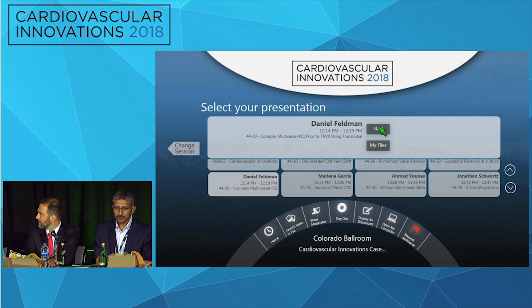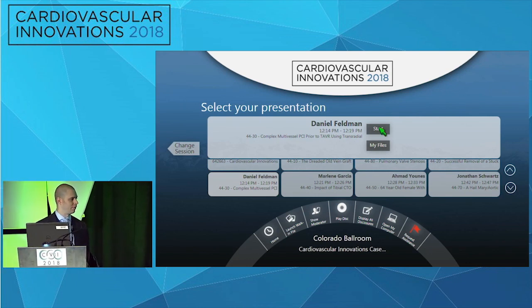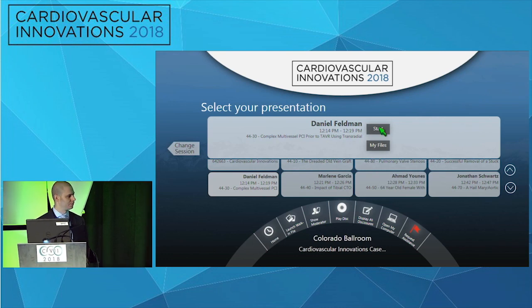Like I said, there's some debate as to what you go after pre-TAVR. I think a lot of it is so they tolerate the TAVR and you don't run into ischemia, especially during rapid pacing. We felt proximal disease, generally most people would revascularize that. I don't know if anyone else has an opinion there. It opens up the possibilities for your various therapies.